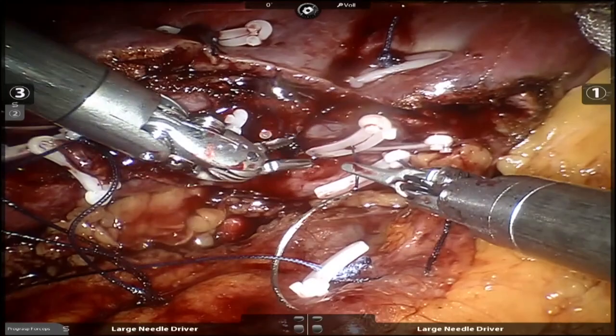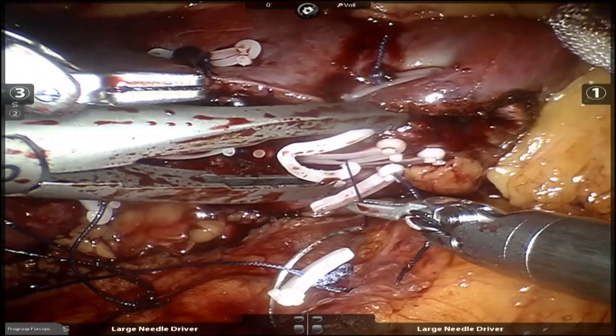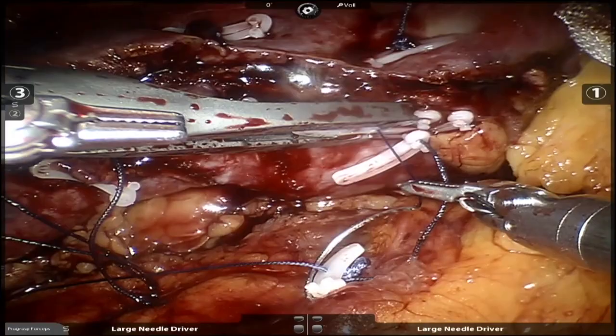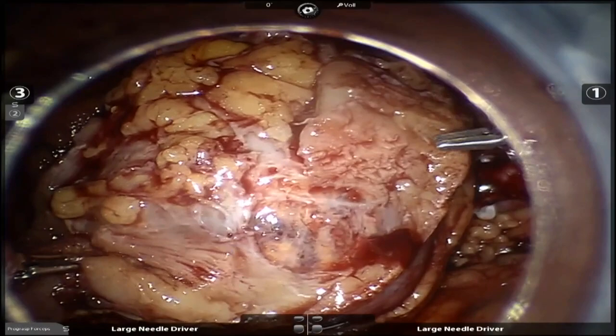Let's go, Brando, right here. As long as it was not the brain, it doesn't matter. Right, exactly. Or the heart. The heart's also good not to clamp. Go ahead right there. Take it out. So that's the one spot we have more, we're a little close there, but I think we're fine. It's intact.